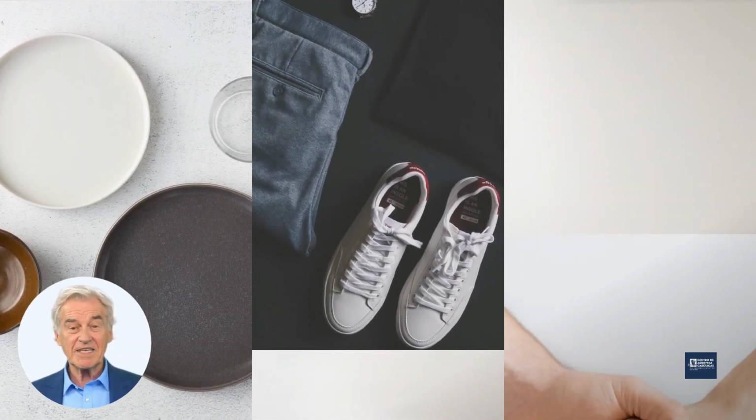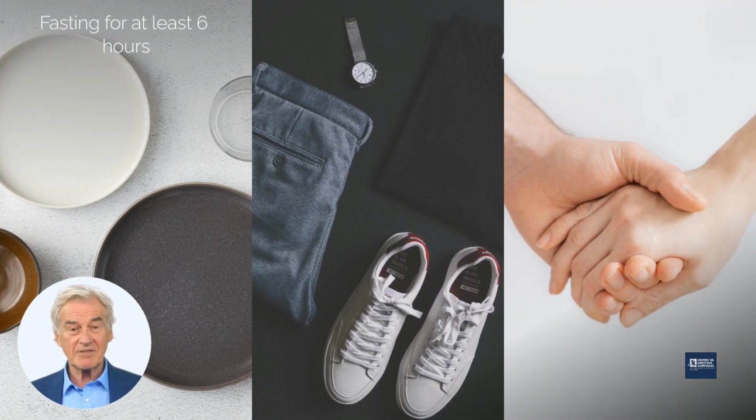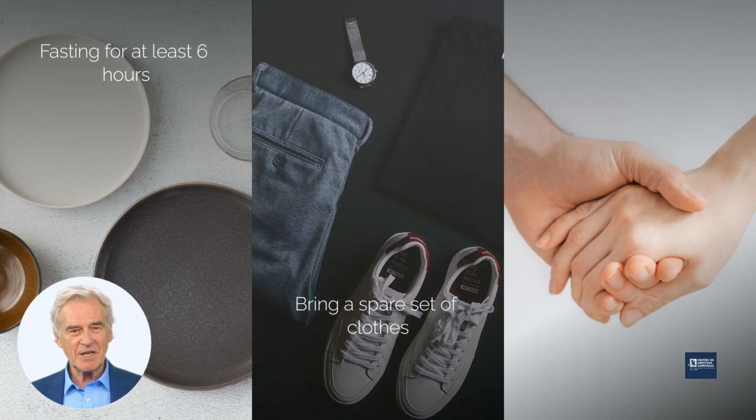In order to perform the exam, the patient should come fasting for at least 6 hours and bring a spare set of clothes. It is also necessary for the patient to come accompanied, as the exam can cause discomfort and dizziness.